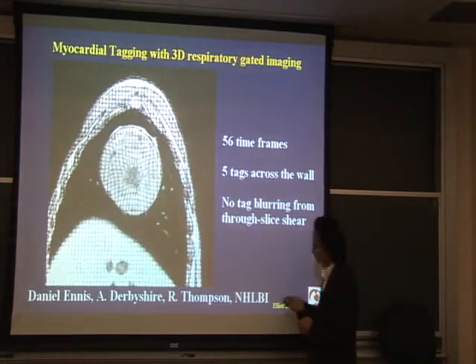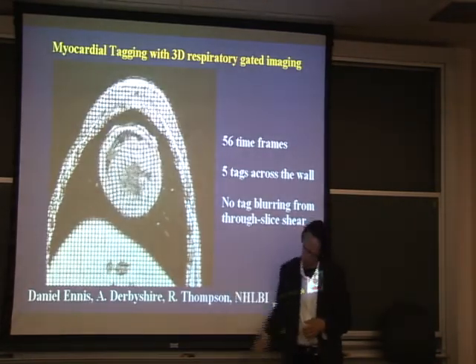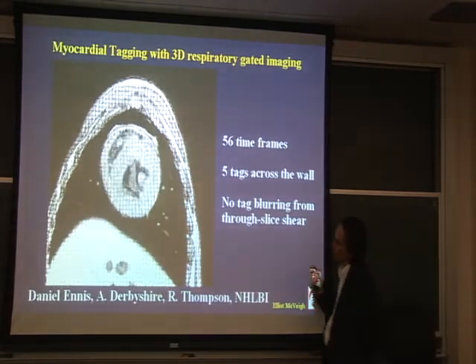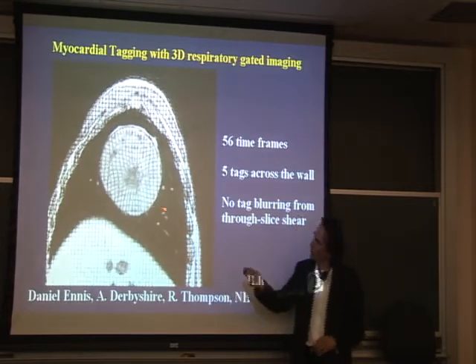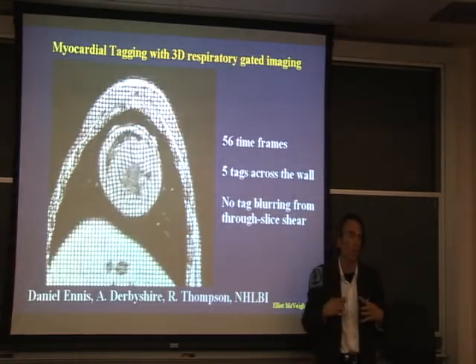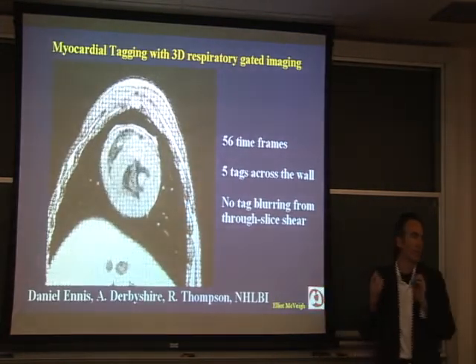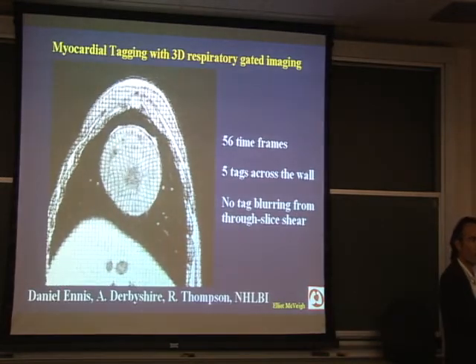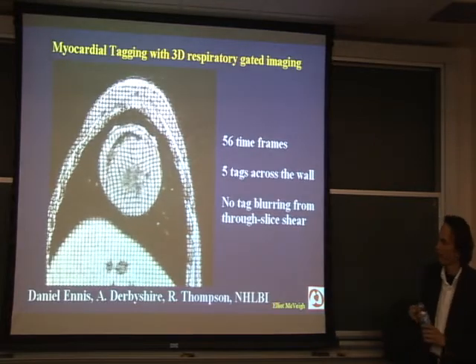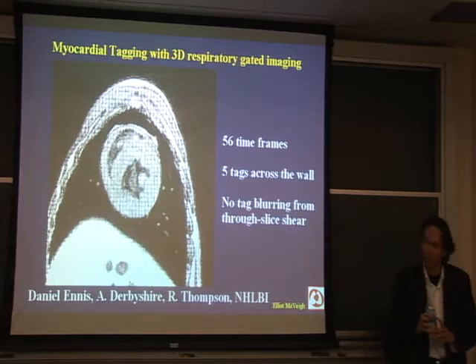Okay. So we make a set of parallel planes this way and parallel planes that way, horizontal and vertical, and then image. Because those planes are tagged to the protons in the tissue, when the tissue moves, you can see that motion and measure it precisely. So it's like putting hundreds of fiducial markers in the left ventricle and then watching it move. So you can measure the radial thickening very precisely, or the circumferential shortening of that muscle very precisely.